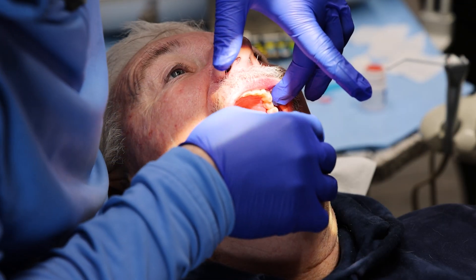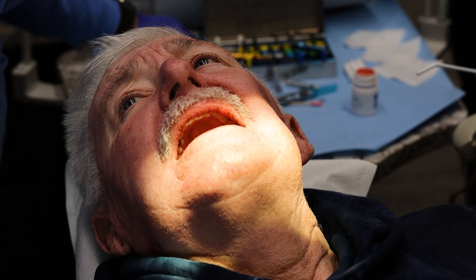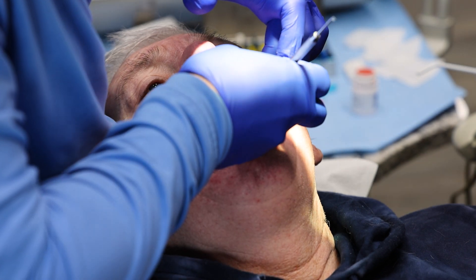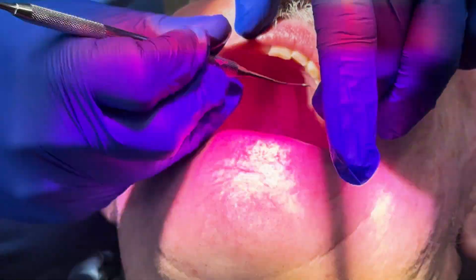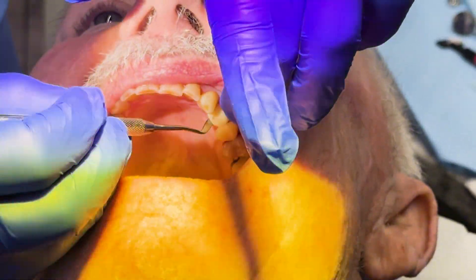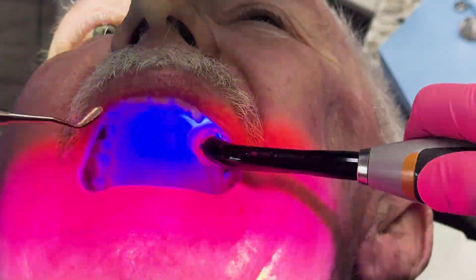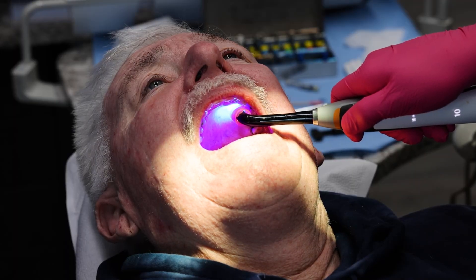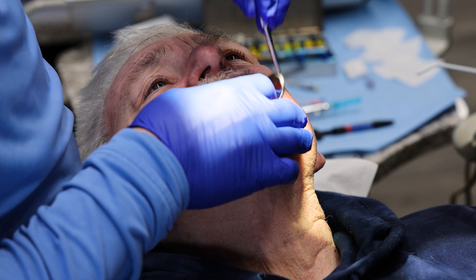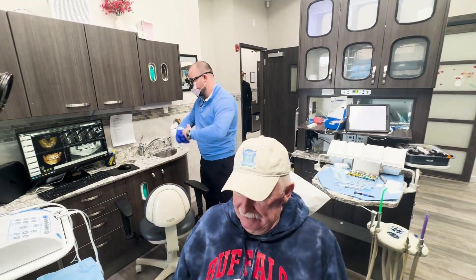Bite down for me — turn towards me. Alright, that is out of occlusion. At the last course a lot of people were asking do I always put my patients on antibiotics after implants, and the answer is yes. I think any time you put a foreign substance in the mouth, you should put an antibiotic on. Now cure that. Bite down, Richard — yeah, it's far out of occlusion. We don't want that being bitten on for at least a month. Okay Richard, we will see you in two weeks to check on that implant. Thanks a lot. You did great — thanks for letting us teach.